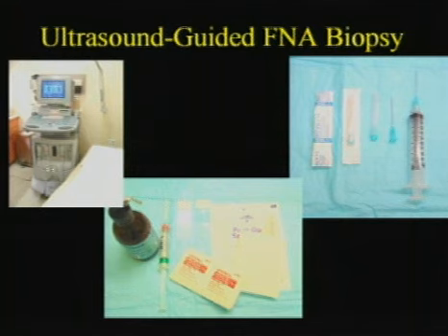Others use topical anesthetic with ethyl chloride, or I use lidocaine just because you do make a couple passes, and with lidocaine the patient only feels one stick. However, it is not really necessary. Then we use a 25-gauge needle, and this can be performed either by itself or with aspiration with a syringe, and this depends on the preference of the radiologist and the pathologist.